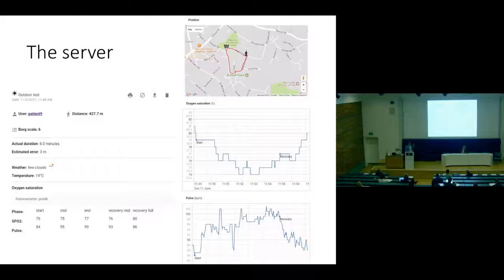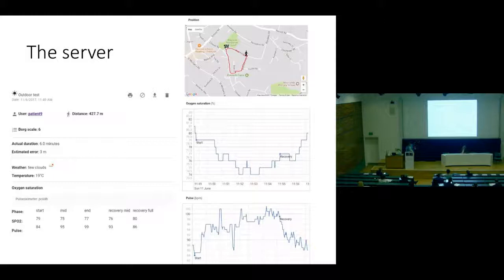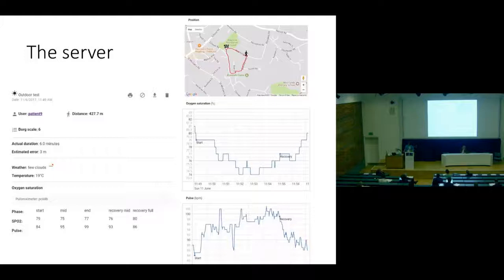This is how the server looks — the web interface that doctors can see. There are all the details for a single test: the doctor can see the distance, the Borg scale, the weather, and the pulse oximetry both as a summary and as a graph. There's also a map showing where the patient has walked, which is useful — for example, you can detect if the person was supposed to rest at the end of the test but didn't, because you can see they walked further.